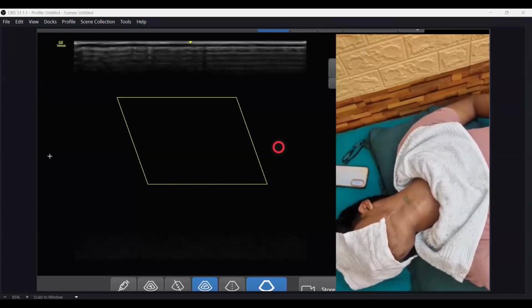That is the most important. While you are selecting your trajectory, at that time release the pressure, try to avoid injuring it. But sometimes it is not possible. I am telling you, in practice, it doesn't happen that it is not injured every time. Sometimes it is blanched and your needle passes through it, but it doesn't usually cause a lot of complication. But we always should try to avoid this.